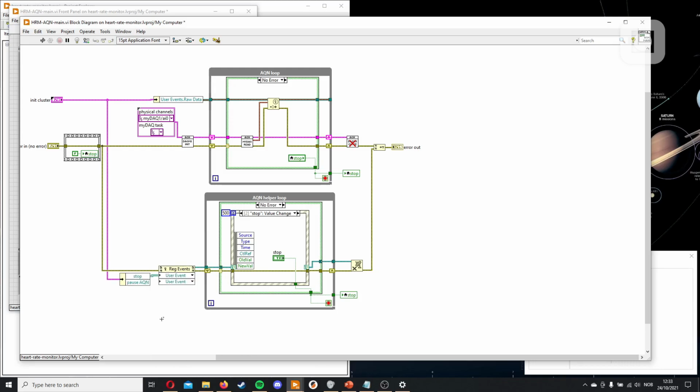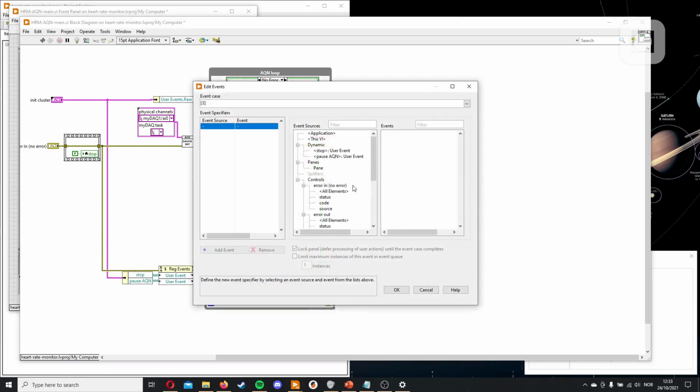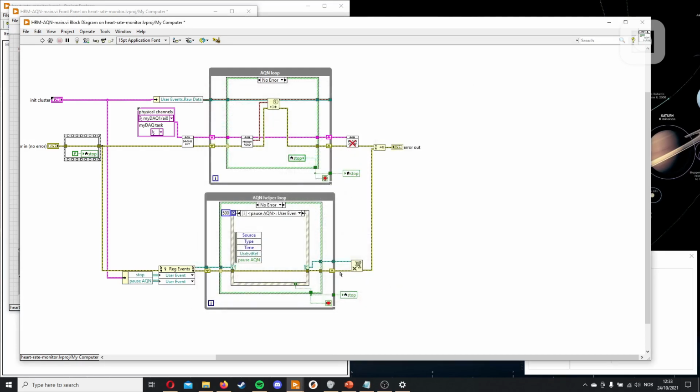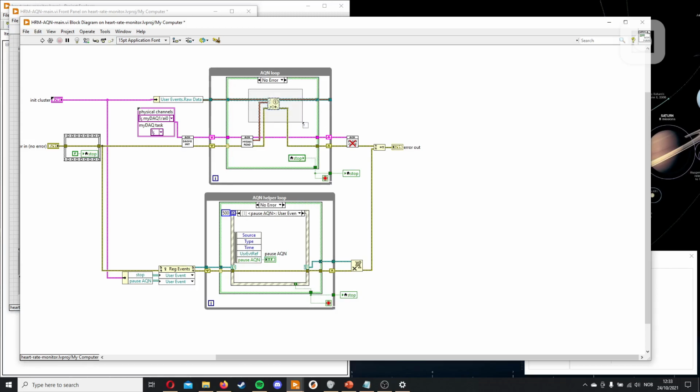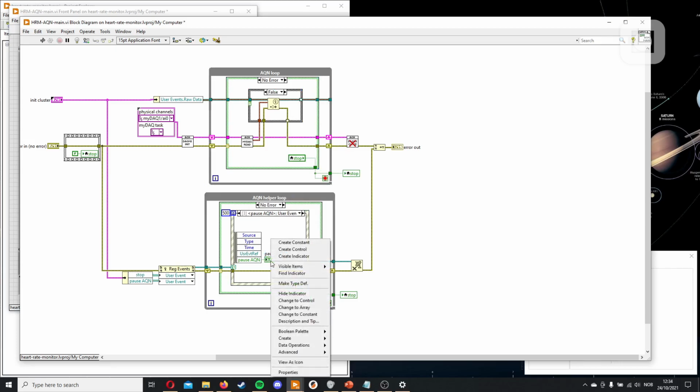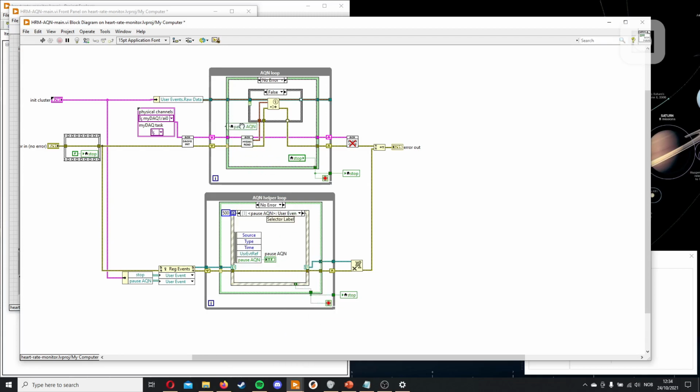And we can just hide the full names, as it's clear that this is user events. We add the user event here, and we can create a local variable here. And we'll add a case around this one, so when this is true, make this case false. So when it's true, it's paused, and when it's false, it's not. Create local variable, put it here. It seems we need a little bit more space, so we can just move this along.